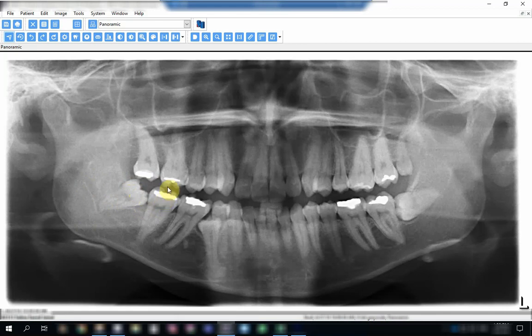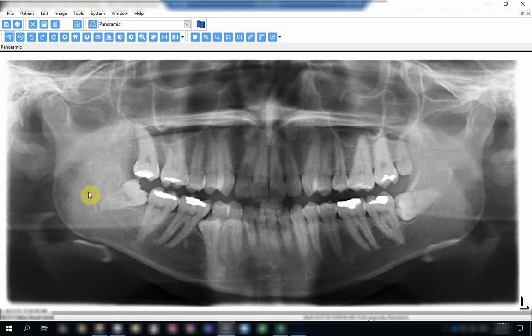It is better to be extracted, especially if the patient has started to complain. In the radiograph, I want you to concentrate on the apex of this tooth.